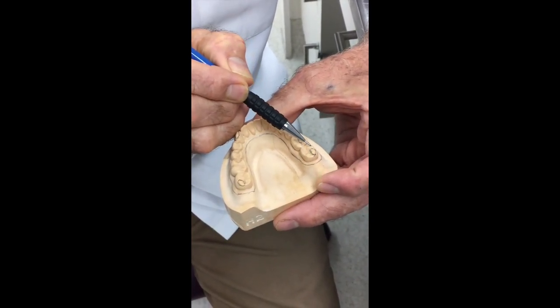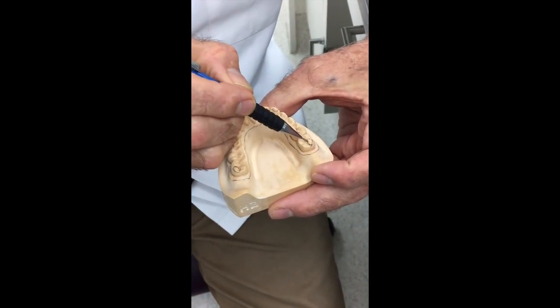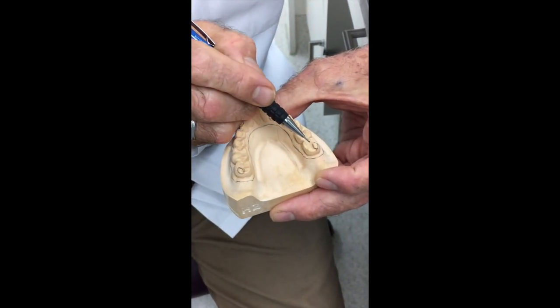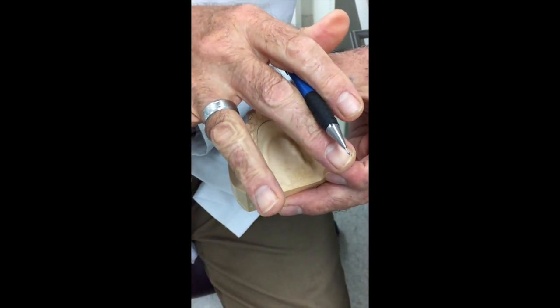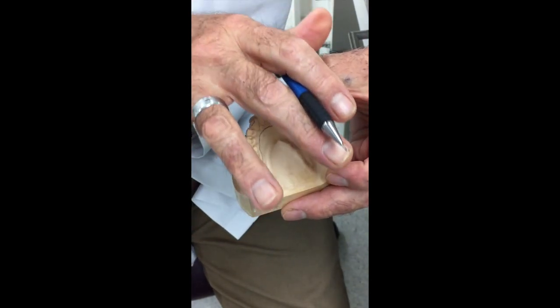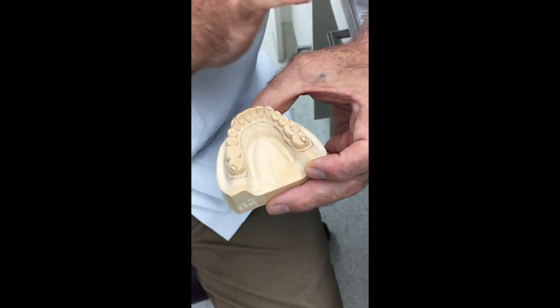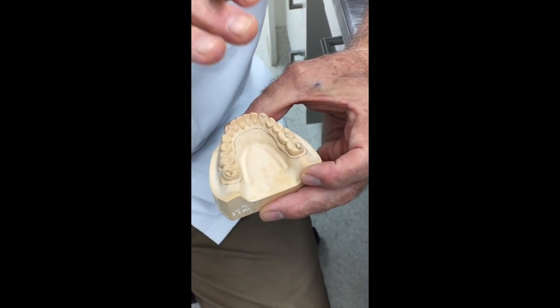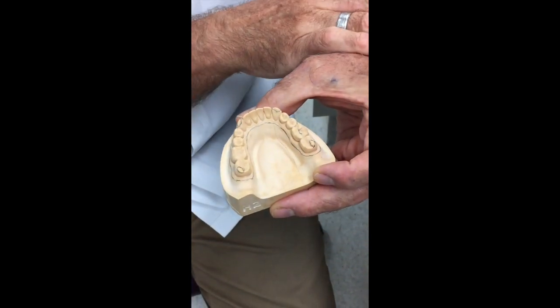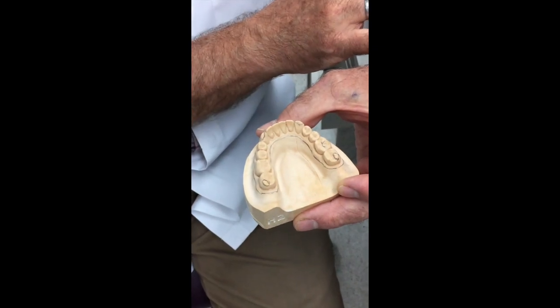The reason that we choose the cusps to seat this on is that when the tray is coming down, if we had chosen a central fossa to put the tissue stop in, and we have the tray a little bit left or right, that tissue stop will seat on a cusp and then not let the tray seat all the way home. So we're going to have a variation in the thickness of our impression material, and that leads to some distortion, where the thick areas set faster than the thin areas and so on. We get little stresses incurred, and that can lead to distortion in the impression. So we want the tray to seat positively, and if it's on the cusp, it's the last thing to contact the tooth. It can't contact prematurely on a cusp, and we get a nice seating. That's why we always put them onto cusps, not into grooves on the teeth.